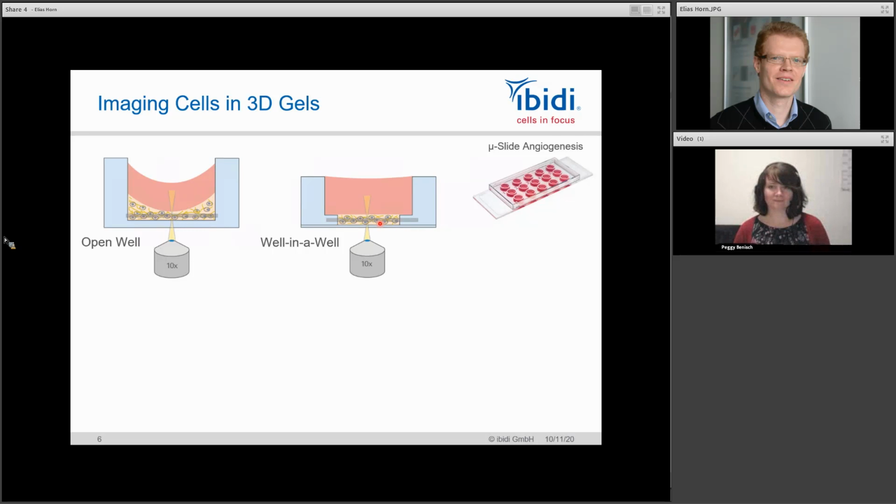But they need to fulfill some requirements. They need to be somehow cell-friendly, and for most cells, you need adhesion inside the gel matrix. Otherwise, they will not attach inside the gel matrix and die. But there are a lot of publications for this around with other hydrogel types. We cannot help here at the moment, but we'll see what the future brings.